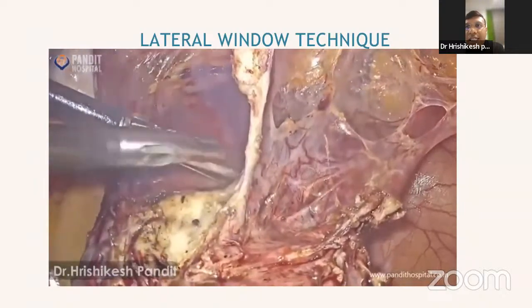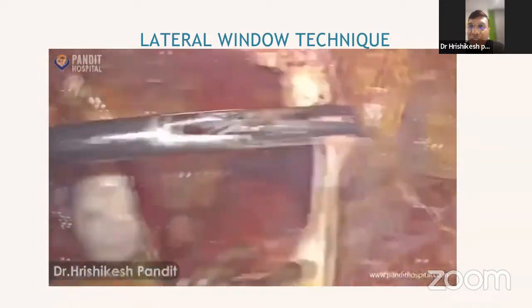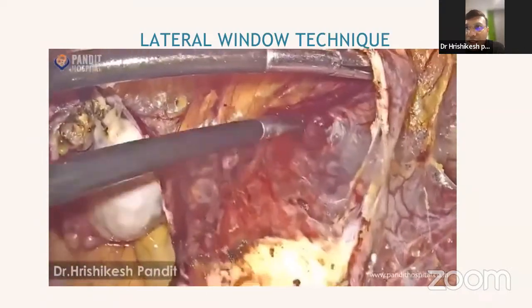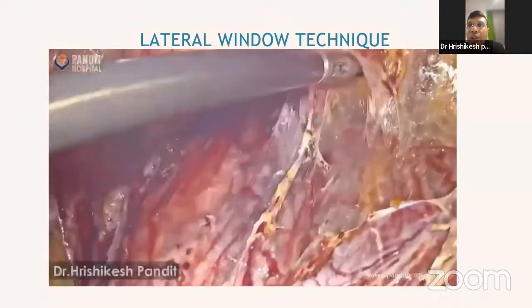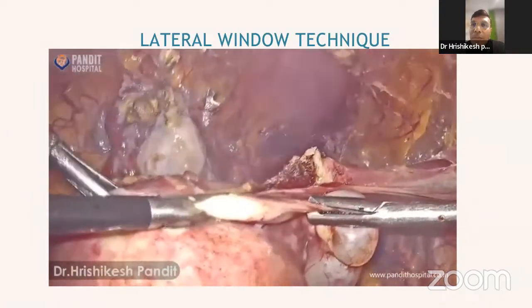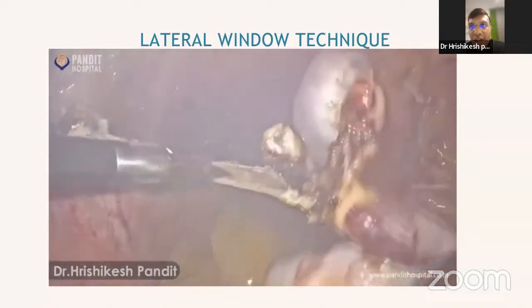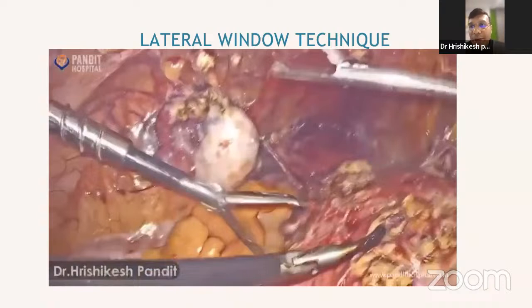Another important thing is the dissection of the bladder pillars. Bladder pillars are the fibers which are over the uterine vessel. So you have to clear the bladder pillars also. Don't rub on the vagina or the bladder. You have to always put the shear, or your right hand instrument, into the bubbles. If you dissect the bladder pillars properly, the entire bladder is going to go down. The complication will occur when you coagulate the uterine artery and cut, and if it bleeds, you still have to go lateral to coagulate it, and then it causes lateral spread and damage to the bladder.